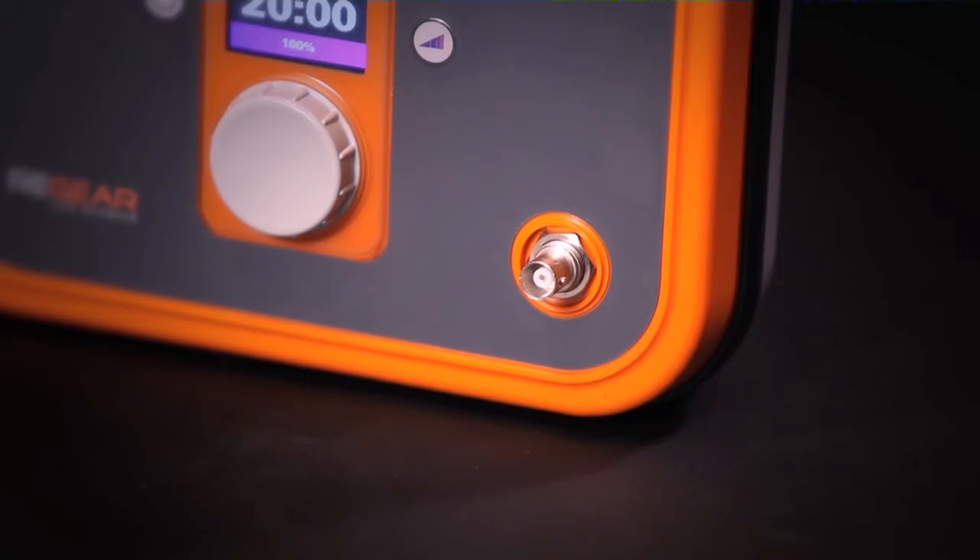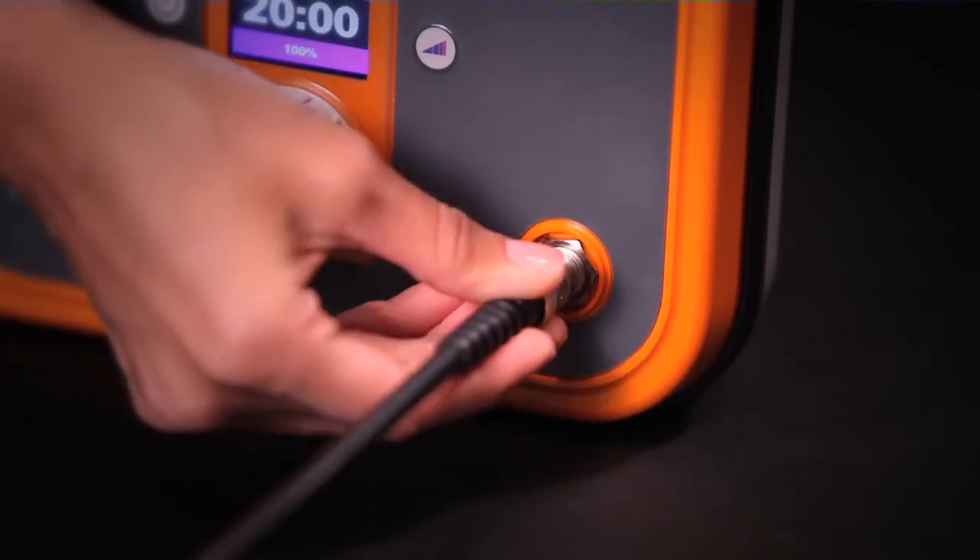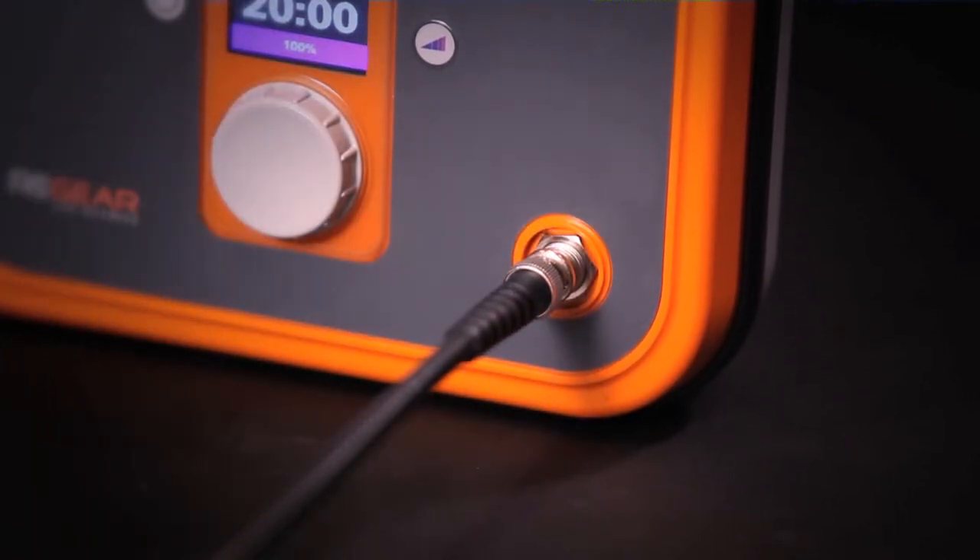Once the appropriate garment is selected, attach it to the regenerator. Firmly push the connector on the garment into the cable connector on the regenerator and turn clockwise until it locks into place.